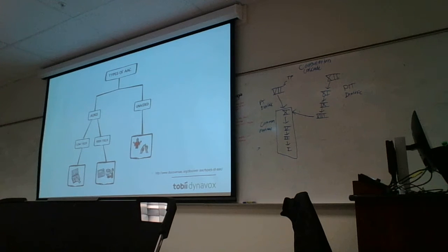So this is a nice graphic just to show you different types of AAC that are out there. Tobii Dynavox offering the high-tech solutions for some of our users. Have you guys seen Tobii Dynavox devices out in the field at all, and have you used some of the software? Yes, yes, no. So there are different options. Our devices are all touch accessible. Some of them do have eye gaze access. They all also have switch ports. So I don't know if you've talked about switch access at all. Not yet. Okay.